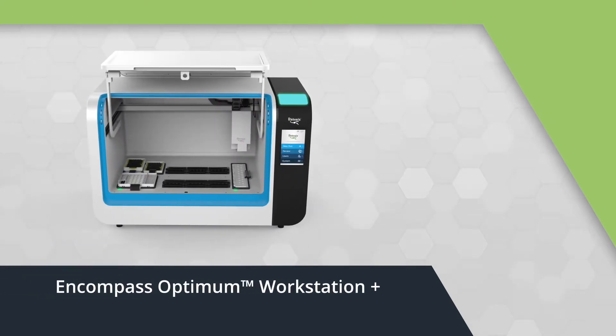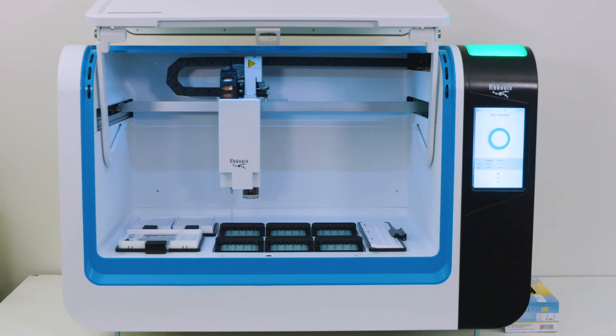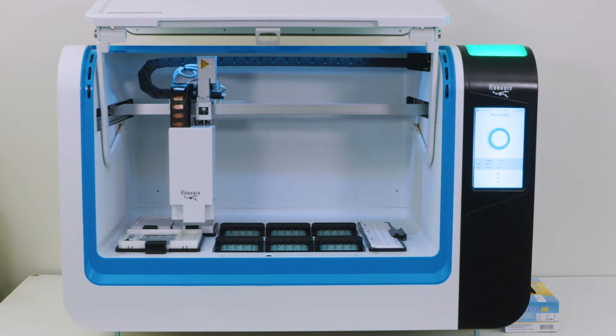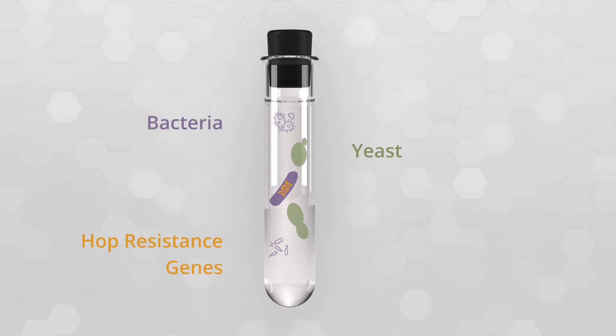At Rheonix, we've created one of the most advanced molecular diagnostic systems available for food and beverage testing, and we've made it remarkably easy to use. Designed with state-of-the-art automation, the Rheonix Encompass Optimum workstation combines high multiplexing capabilities with a nearly hands-free workflow. With the ability to detect many targets directly from an enrichment, the Encompass Optimum provides more information per sample than any other molecular food and beverage testing system.